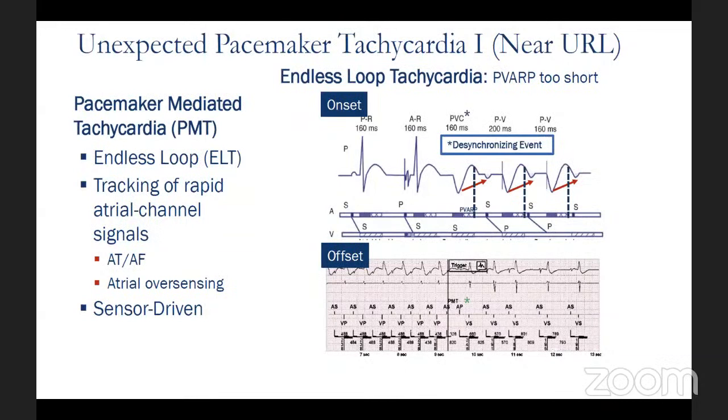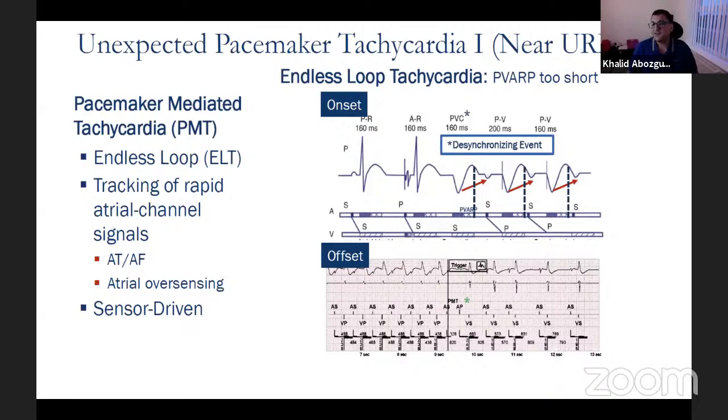This is number one. Now nobody is really concerned about migration of the lead, or that it's going to cause any burning sensation to the patient while you are doing the MRI. And many institutions are changing their protocol too. That's exactly why, Yusuf, just to support what Wael said, when I started in my center, they didn't MRI any patient with ICDs. Now, 6 years in, we do it.